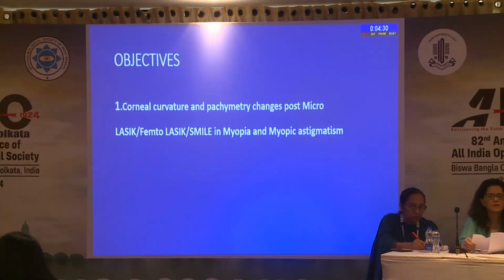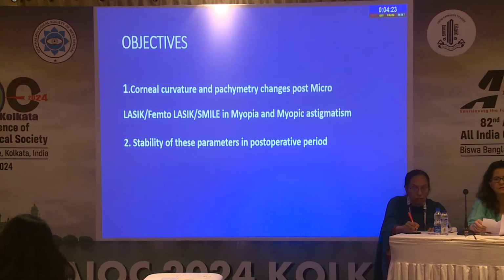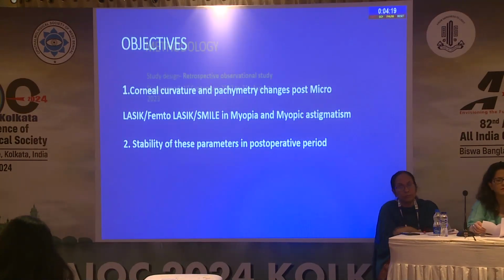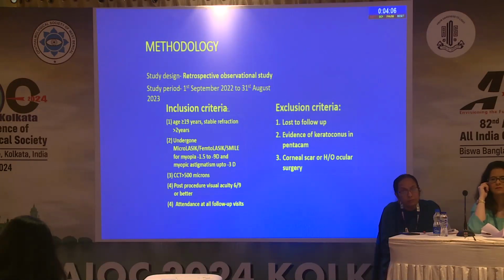So the objectives were to compare the corneal curvature and pachymetry changes post microLASIK, femtoLASIK, and SMILE in myopia and myopic astigmatism, and to see the stability of these parameters in the post-operative period. We designed a retrospective observational study and included those who had undergone these procedures for myopia and myopic astigmatism and had a post-procedure visual acuity of 6/9 or better, and excluded those who were lost to follow-up.